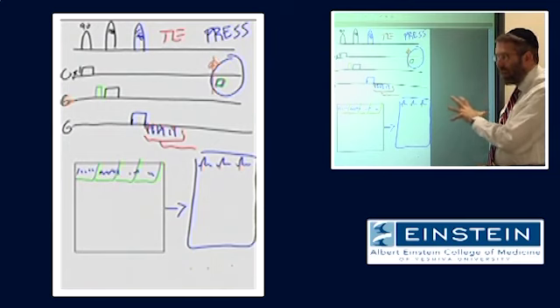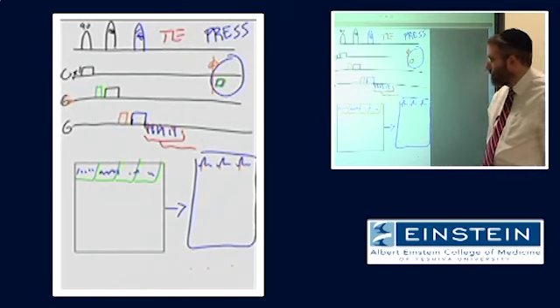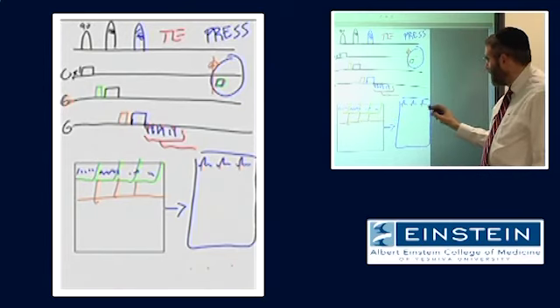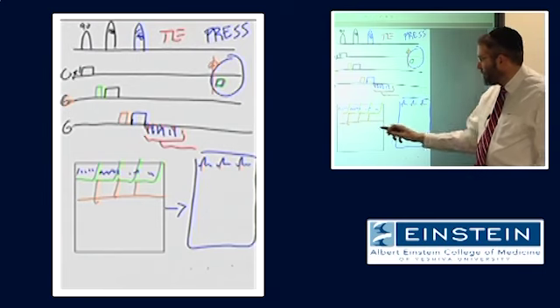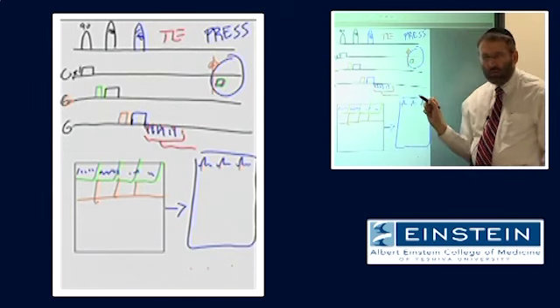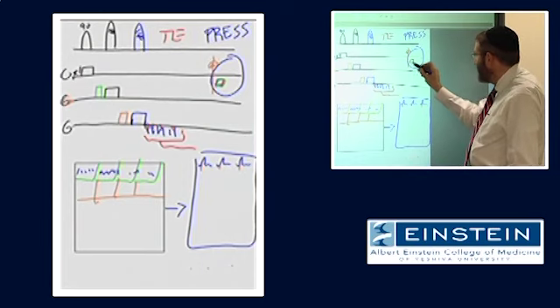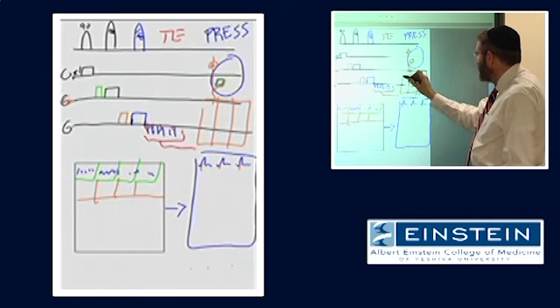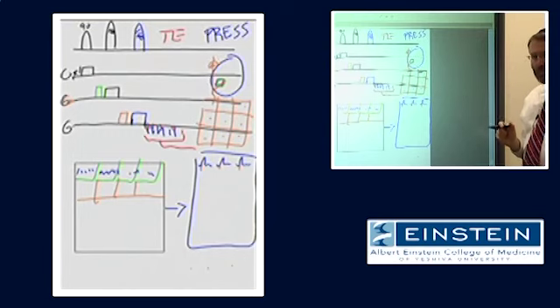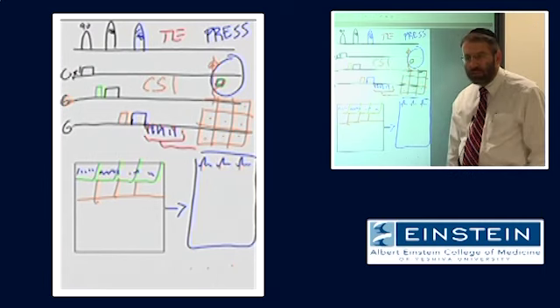And if we take all of that and iterate it again, turning on an extra application of this third gradient magnetic field, we can then repeat this entire process, and then Fourier transform from spectrum to spectrum this way and sort our signal out from left to right. What this allows us to do is to take this area that we've looked at and separate it into a grid. And from each of those locations in the grid, we can derive a separate spectrum. So this is called chemical shift imaging or multivoxel spectroscopy.